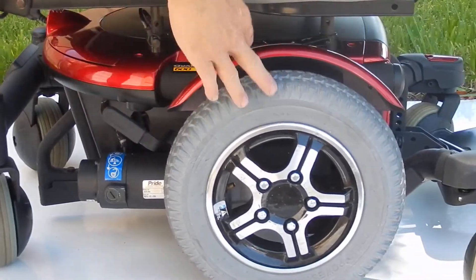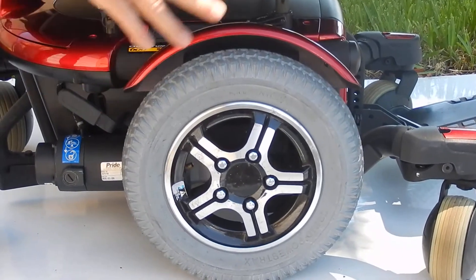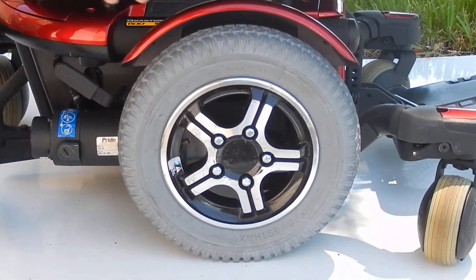This chair has solid wheels in the front. It has air tires in the middle. We can put solid tires all the way around if needed.